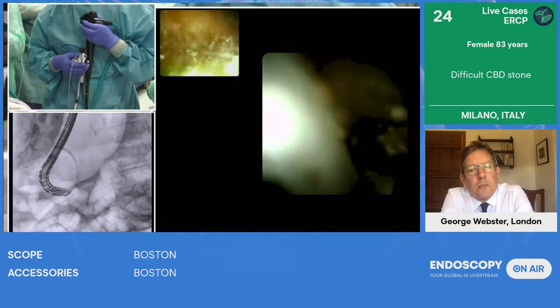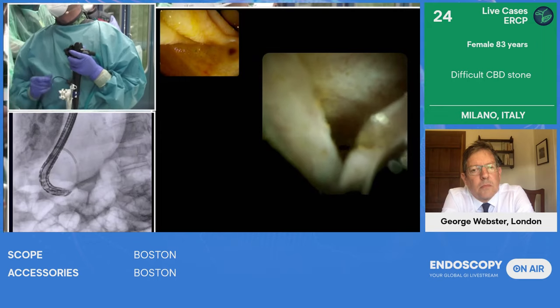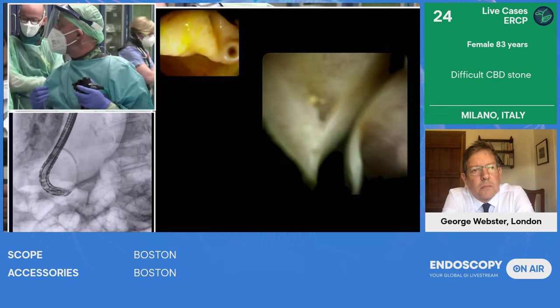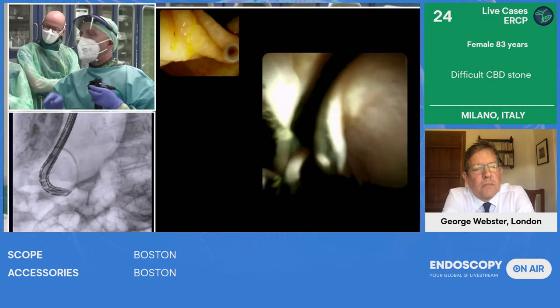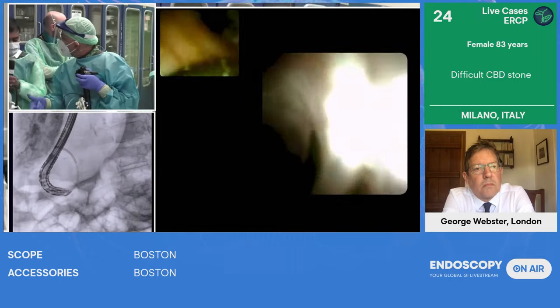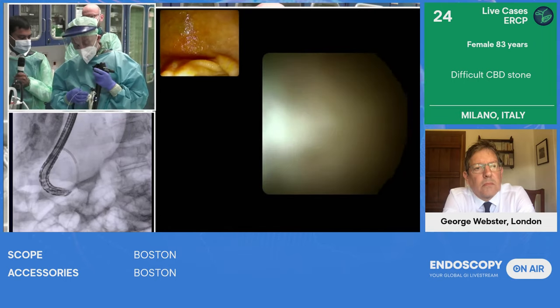What do you think? I totally agree, as usual. I would add one more situation that is related to your own experience. Sometimes you may face a stone that is not too difficult in general, but maybe it's too difficult for your condition, your experience, the timing of the procedure. So it's very, very important to check for everything.